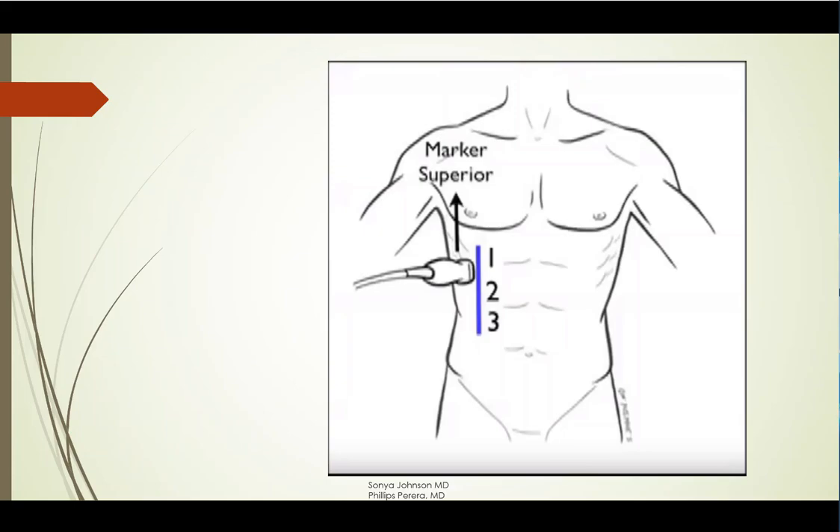The first view represents sub-diaphragmatic. The second view represents Morrison's pouch. And the third view — you want to make sure that you get the liver tip and the inferior pole of the kidney, because sometimes blood can hide back there.